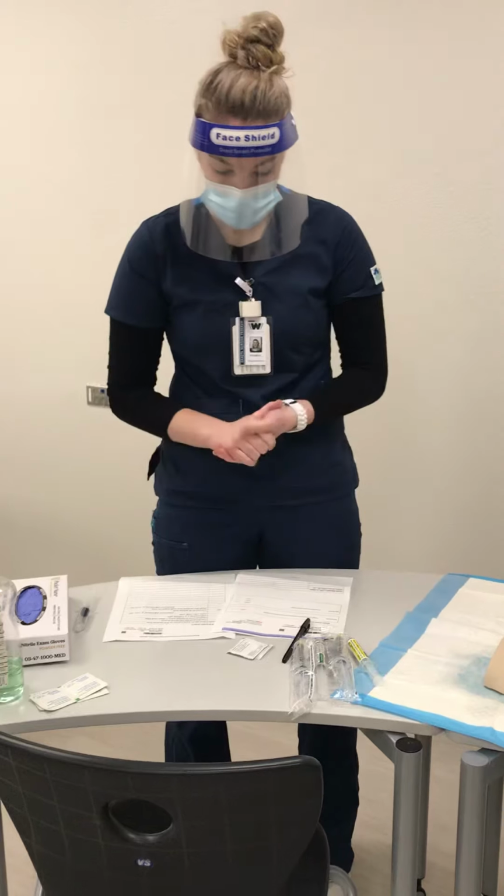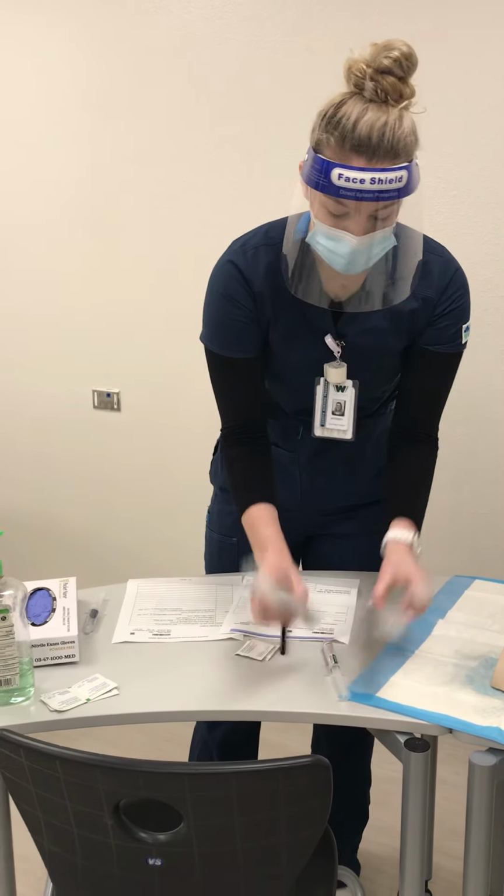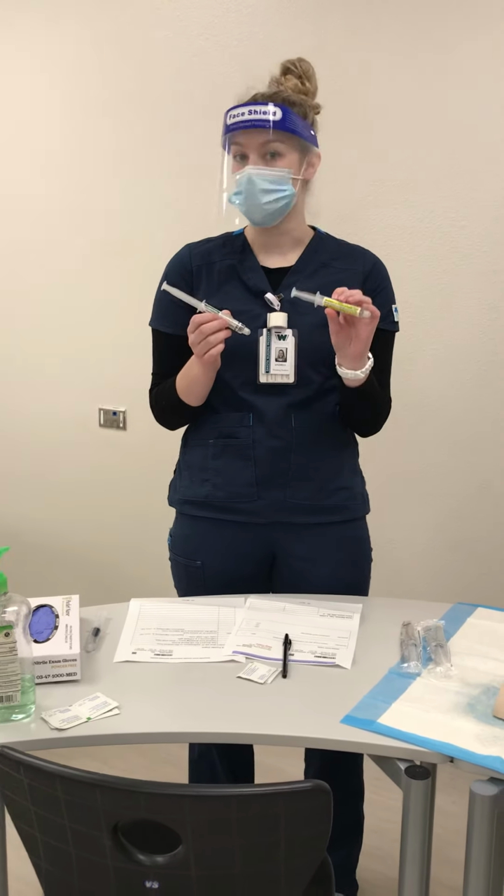So I'm going to perform hand hygiene, and now I'm back in my bedroom because I see I have an order to administer ceftriaxone 1 gram. So I'm going to need to pull from my Pyxis. I have my 2 saline flushes. I need to pull from my Pyxis my ceftriaxone and my heparin flush as well.